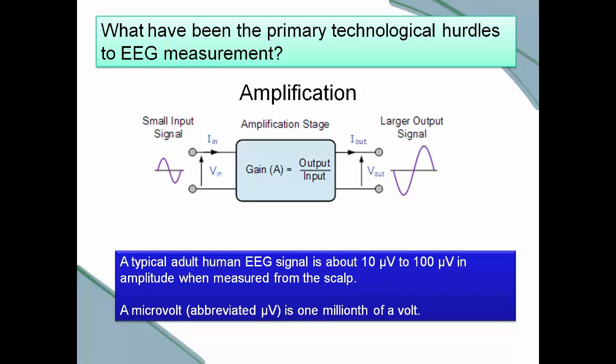How can you take that same signal and amplify it so that it will drive an indicator or a polygraph pen or an ink pen or sensors in a computer that, given certain inputs, will cause the monitor or the screen to respond in a certain way? We have to amplify it.